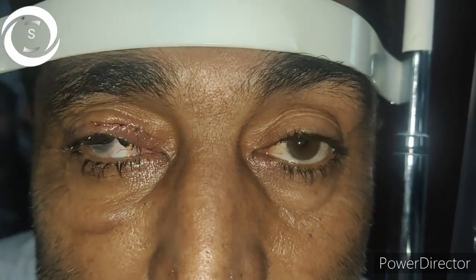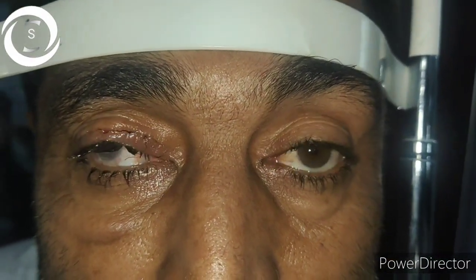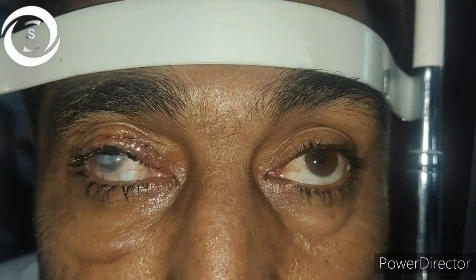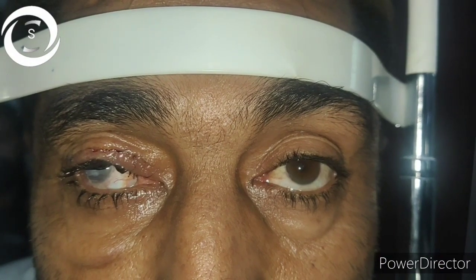I told him clearly that I can correct the ptosis, but that it will then expose the corneal appearance, which is currently hidden by the closed lid. However, he insisted to go for the surgery. So I corrected the ptosis for cosmetic purposes. I checked his levator function and it was 4 to 5 millimeters, so I decided to perform levator resection and advancement.